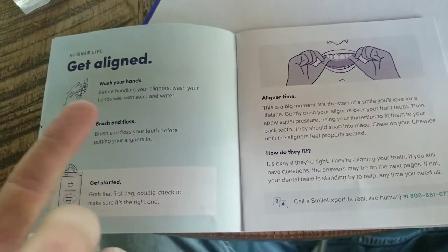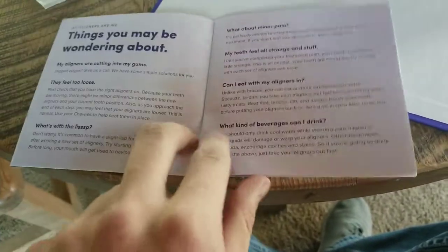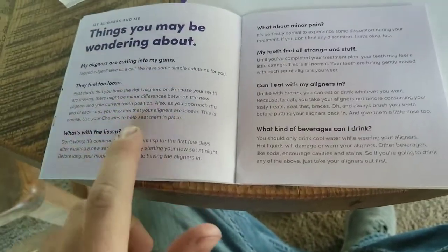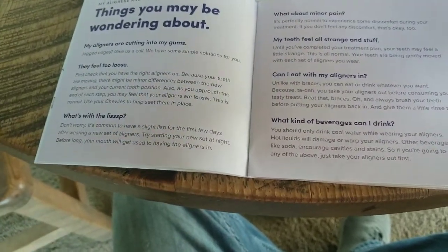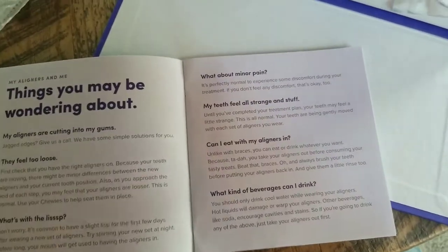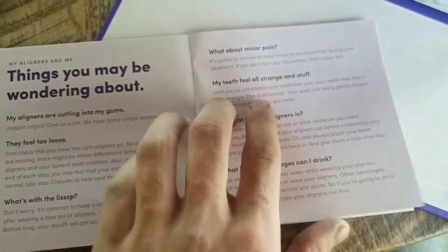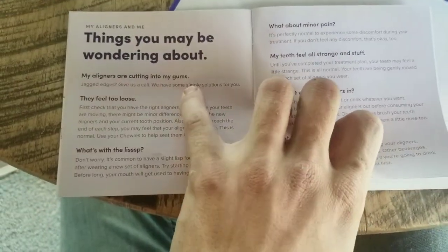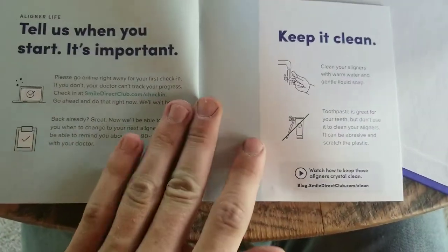Watch where you put them in, brush and floss before you put them in. For drinks other than water, just take them out. Right here it says don't worry — it's common to have a lisp for the first day. I'm going to try to make a journey video to see how things go. There's no pain right now — they were tight when they got on but it's just something you get used to. If it cuts into your gums, give them a call. Don't smoke, don't chew gum — I feel like that's pretty obvious.